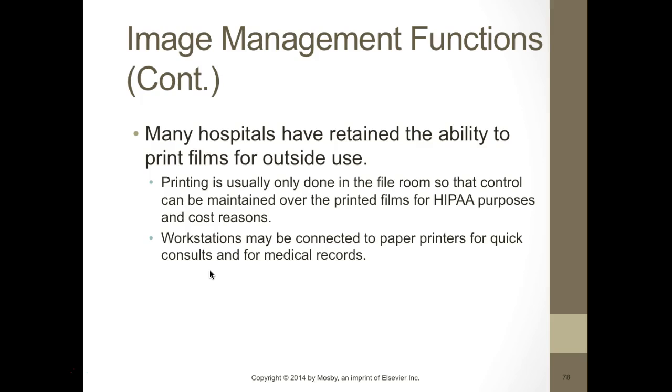It's, like I said, very expensive, and if it's going to be used for education, you can anonymize them and print them. A lot of them are going to paper, so my hospital went to paper copies where there's actually not even an option for them to have films. So workstations can be connected to paper printers for quick records that pop right into the chart.